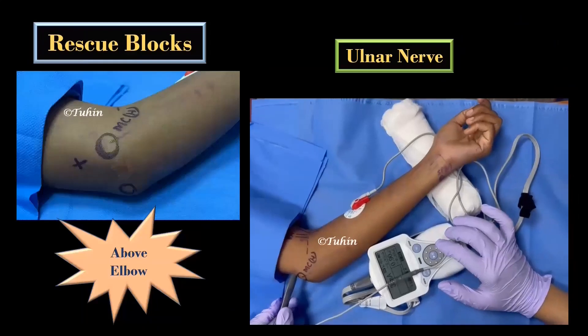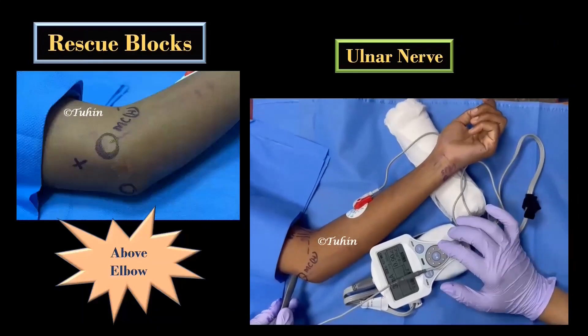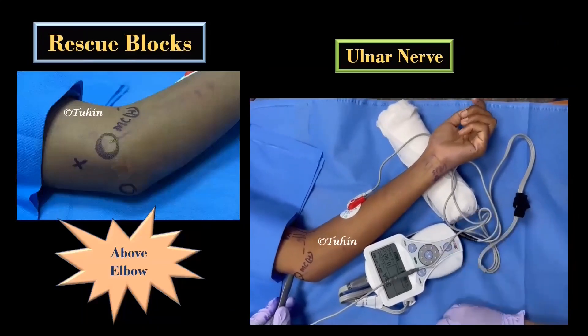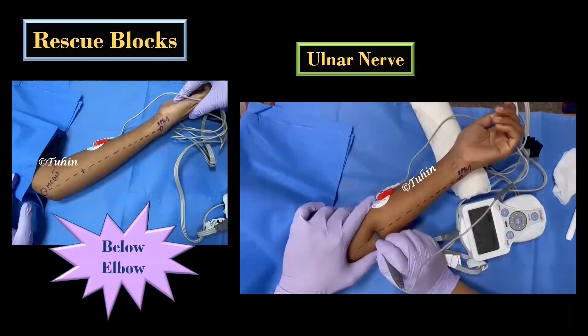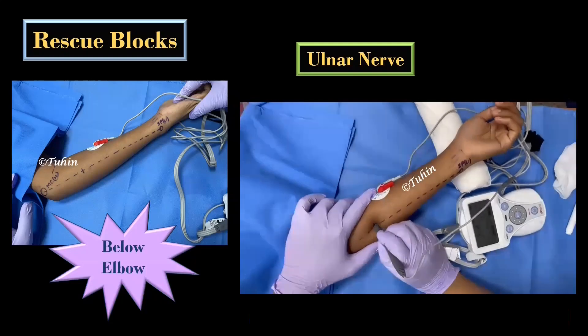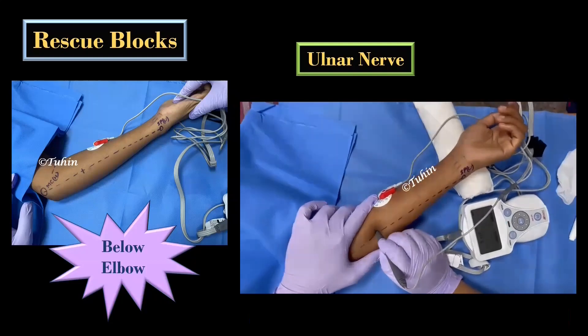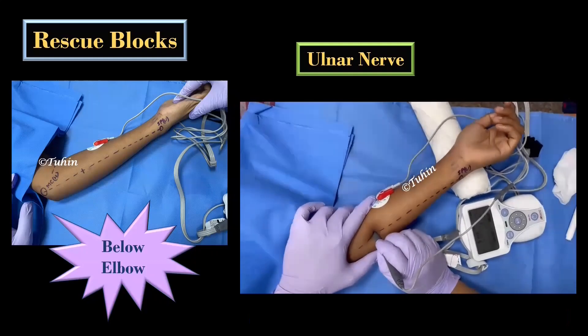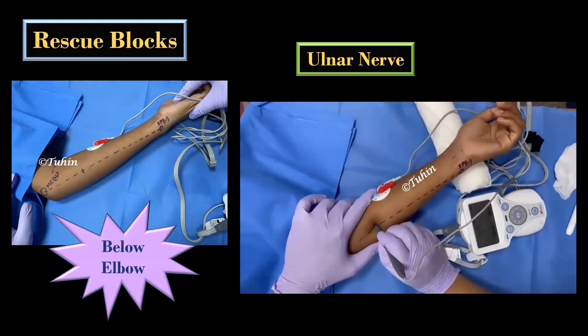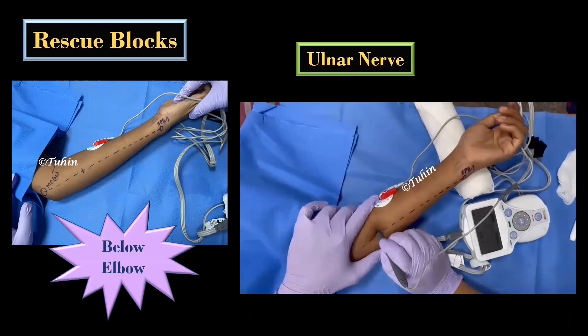For the ulnar nerve block above the elbow, the needle insertion point is 1–2 cm above the level of the medial epicondyle in the ulnar groove. For below the elbow, the line joining the medial epicondyle and the styloid process of the ulna is divided into 3 equal parts. The junction of the proximal one-third and distal two-thirds is the point of needle entry.